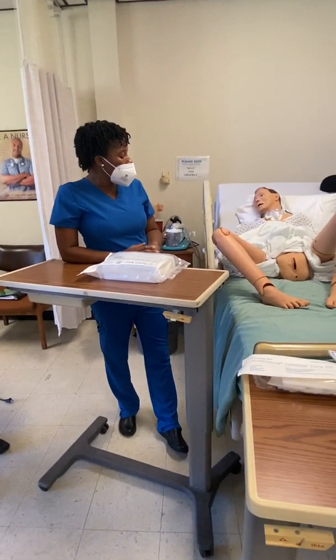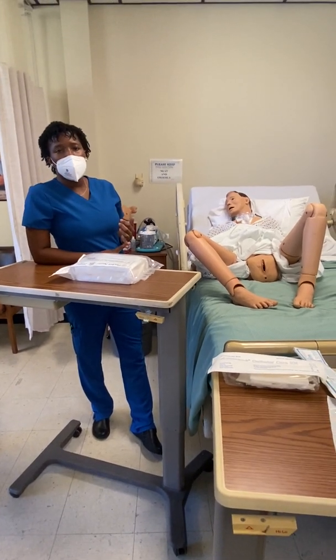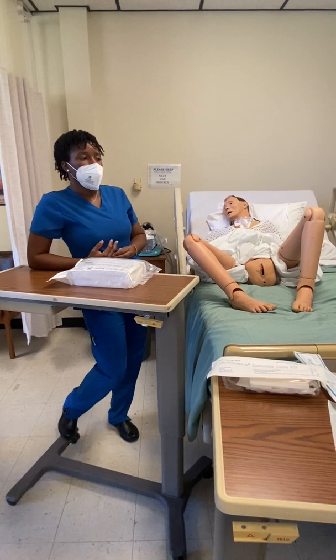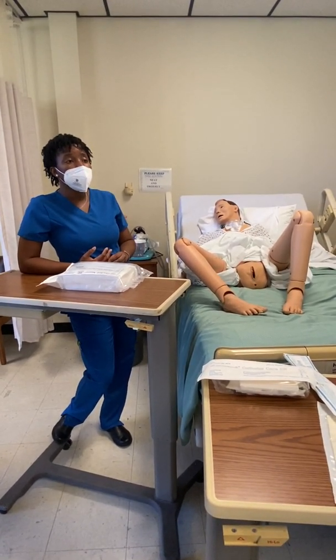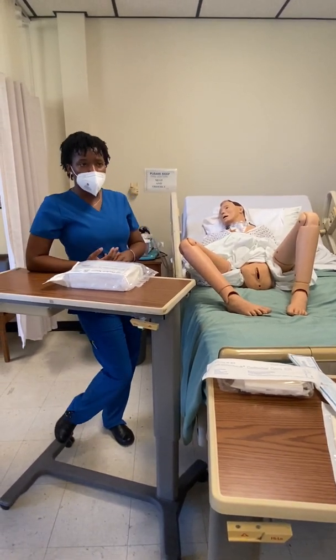So, we're gonna get ready to insert this catheter. We've identified our patient, we've washed our hands. What are we gonna check for now? I can't hear you. Allergies, we did that.